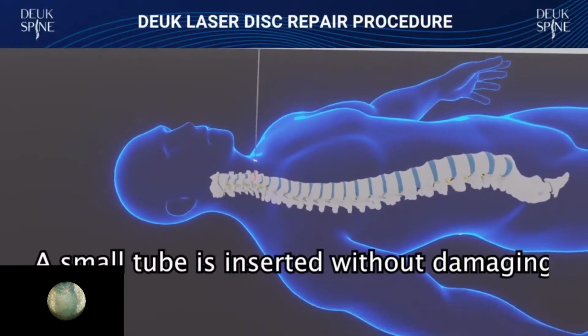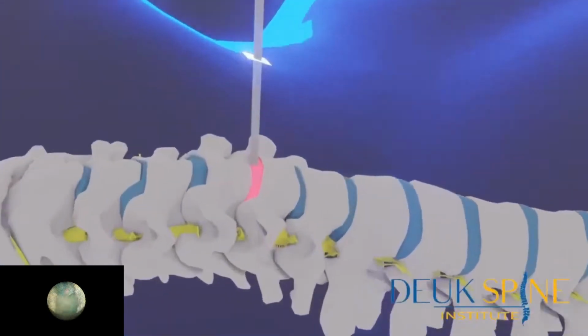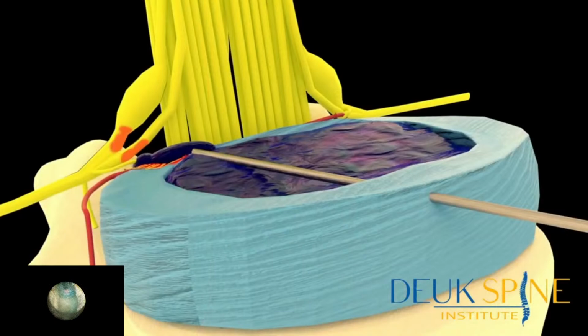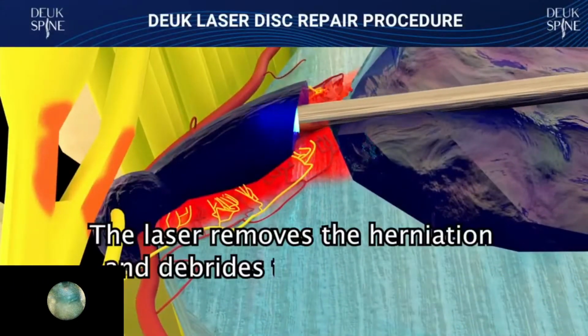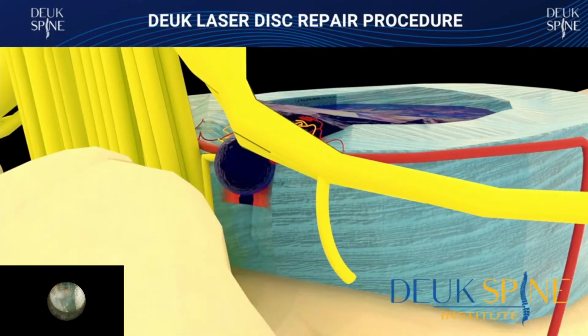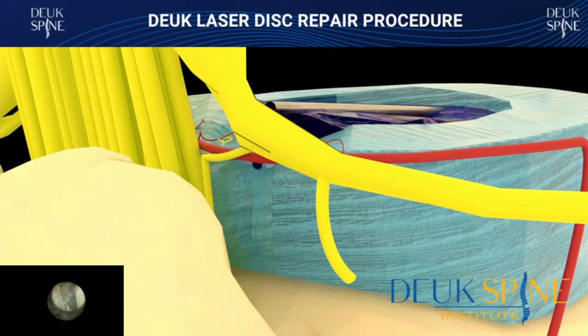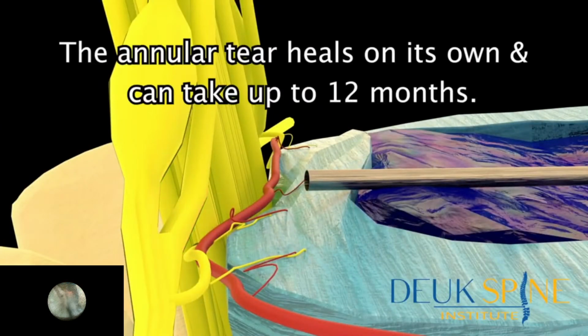A small tube is inserted without damaging the bone or soft tissues. The laser removes the herniation and debrides the annular tear. The annular tear heals on its own. It can take up to 12 months.